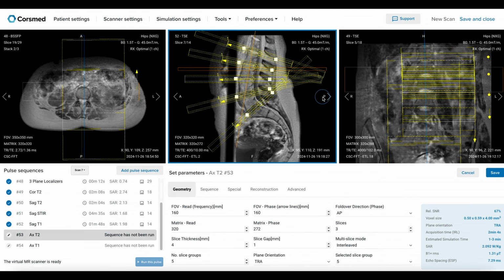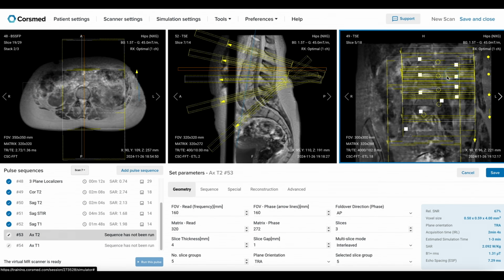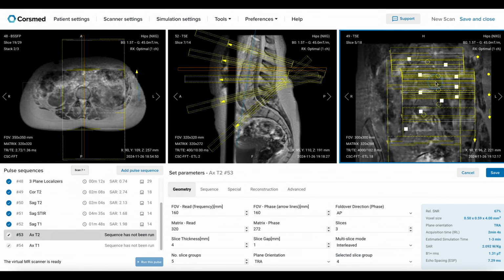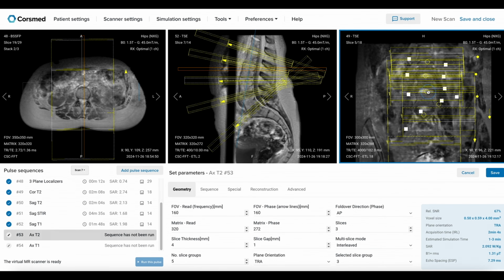In addition to centering anterior to posterior, proper left to right centering is also crucial. We can use the coronal plane for this purpose. In patients with scoliosis, significant angular deviations are common. It's therefore important that we verify our angulation of all intervertebral spaces. We will check each stack individually, centering and angulating it as needed.